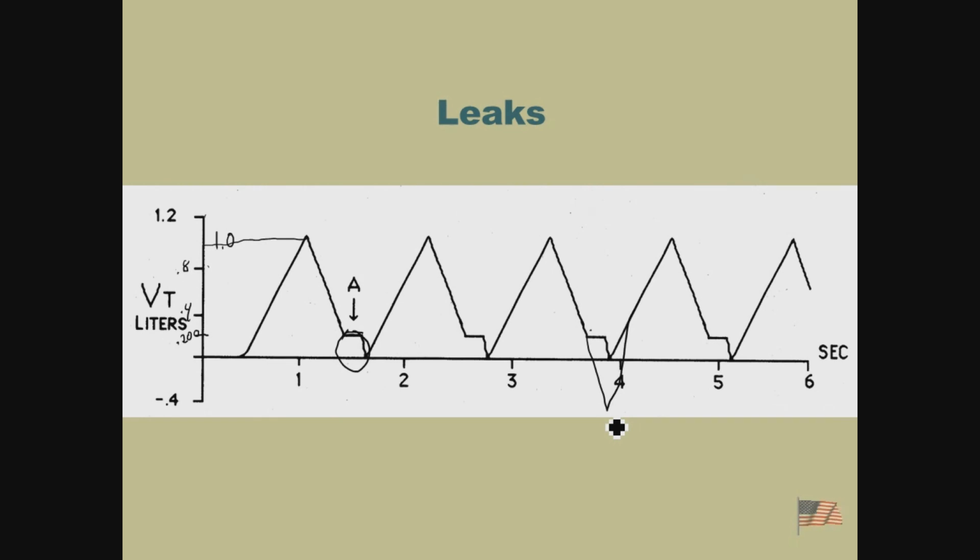But then the volume curve itself will say, that's the volume that's coming, it's returning all the time, but it's trapping. Say I am trapping a couple. At some point, the patient's just going to exhale a larger tidal volume than you put in. Oh, okay. That's where the machine will know. Yeah, you'll see it actually go into the negative.